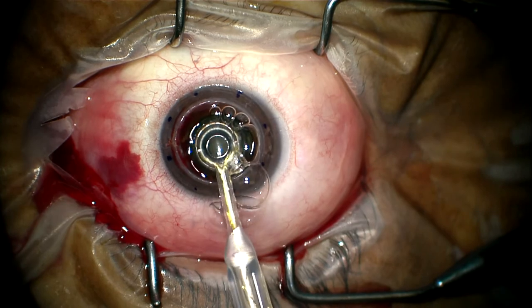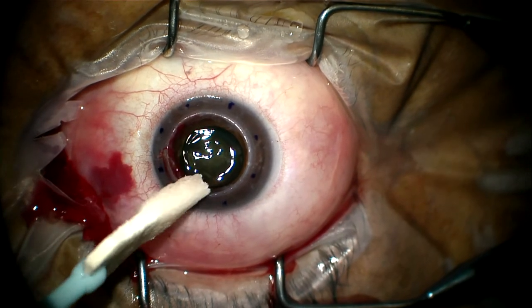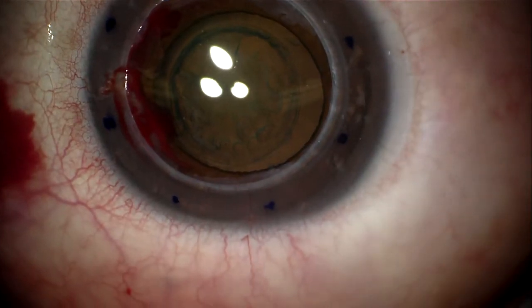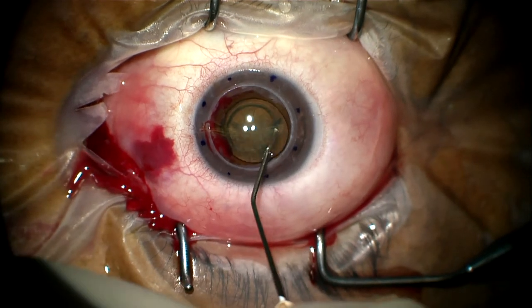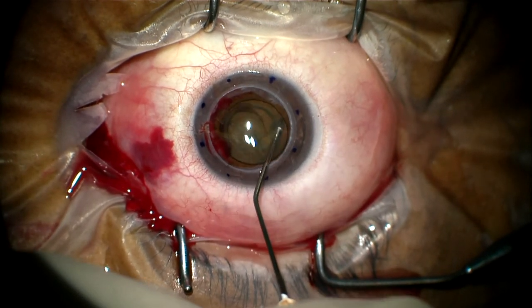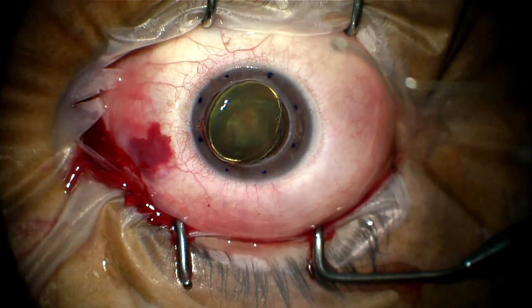The strong, smooth edges of the capsulotomy are easily visualized. The complete lens is expulsed with hydrodissection without tearing the capsule. This is extremely difficult with manual CCC or a can opener method.